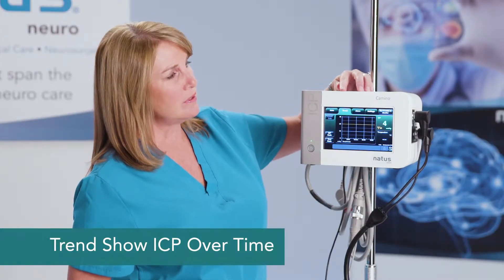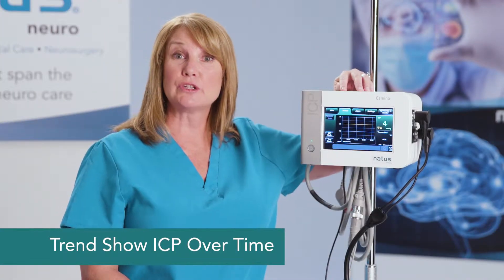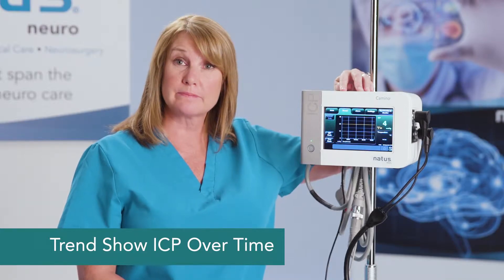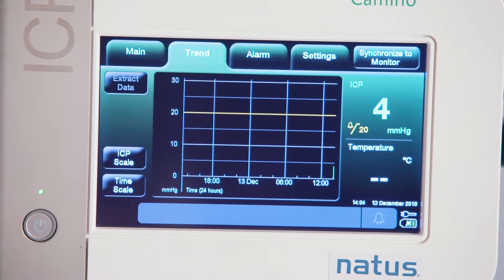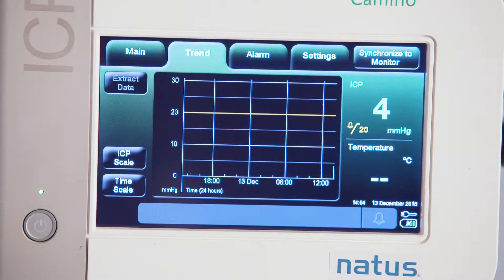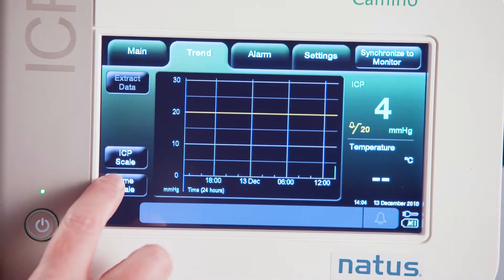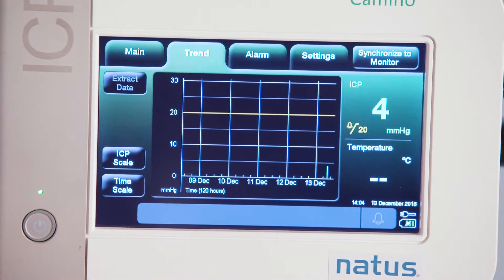The trend tab is where we're able to go back and look at ICP over time. On this tab, we can look at ICP value as a bar graph at 3 hours, 12 hours, 24 hours, 48 hours, or up to 5 days worth of data. In order to change that scale, we simply touch where it says time scale and we're able to look at our trend data.